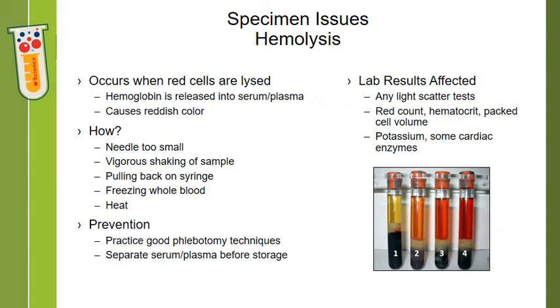How does this happen? A lot of it has to do with phlebotomy technique. If the needle being used is too small, or if the syringe plunger is pulled all the way back, the red cells shoot through the needle and lyse when they hit the syringe walls. If a sample is vigorously shaken after collection, that can also cause the red cells to lyse. We always want to educate anyone who draws blood to invert gently, not shake those tubes. Hemolysis can also occur when whole blood is frozen, or if it sits too close to a heat source. Be aware also that patients can have intravascular hemolysis, so it's not always a blood draw issue, but a lot of times it is.